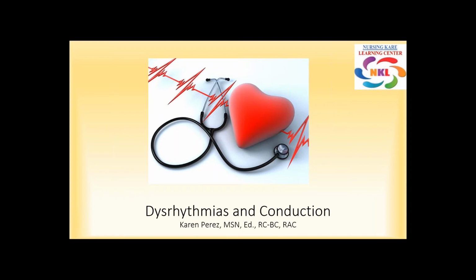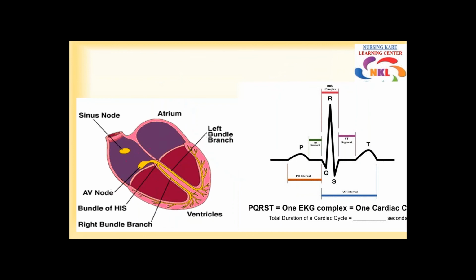We're going to be talking about dysrhythmias and conduction. Okay, so with dysrhythmias, it's actually talking about the electrical conduction. How is it that the heart itself contracts? So as we know already, the pacemaker of the heart is actually the SA node.